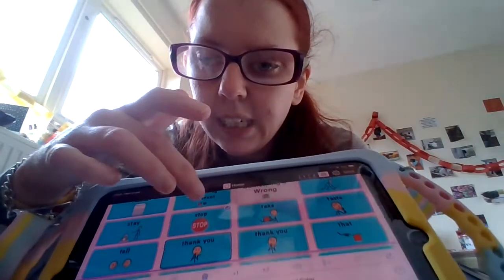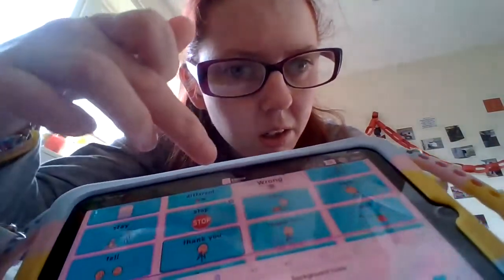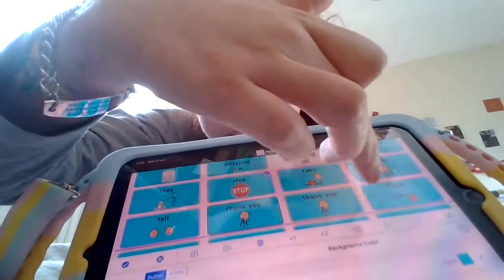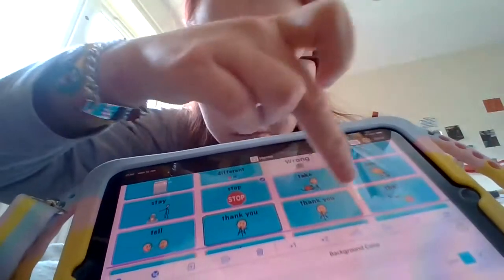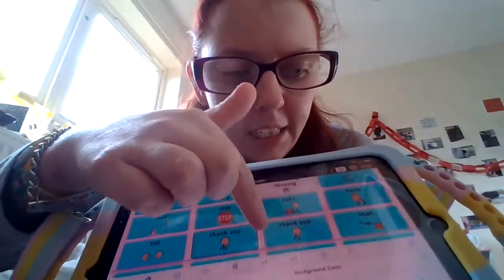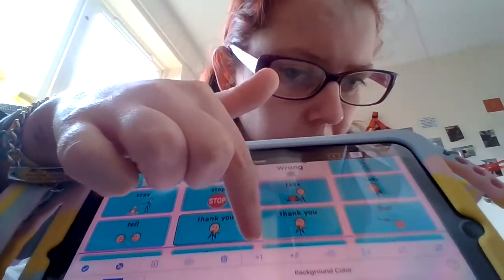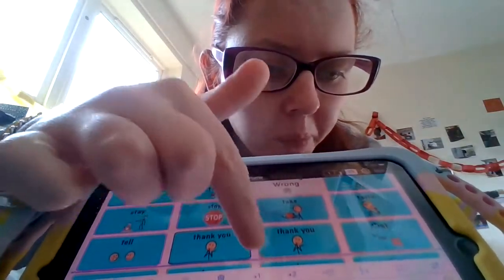To add it, you click on it and then you go to the very top of this row here, look, there's numbers, there's a move to storage button, and then there's 1 and 2, which are the pages that I've already got loaded. To add it to a page, the little arrow next to the 1 is move to 1, the little arrow to the 2 is move to 2, and I will click move to page 1.